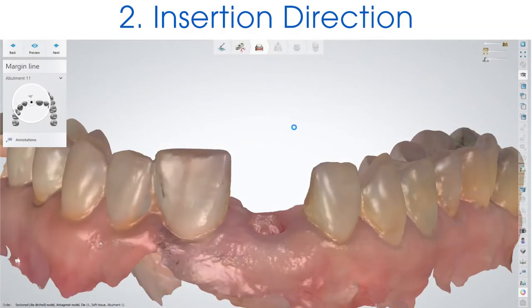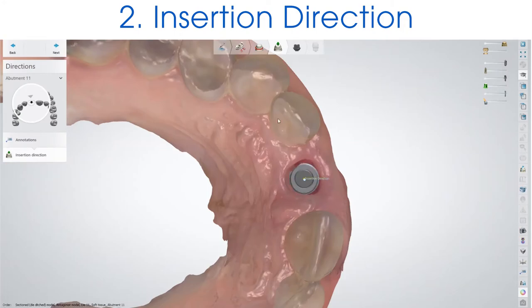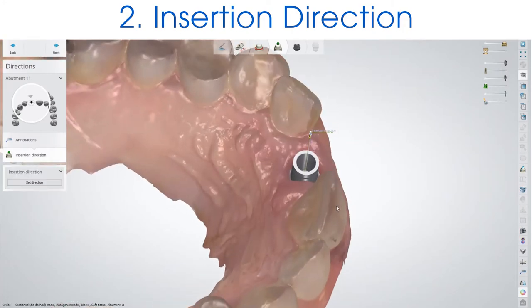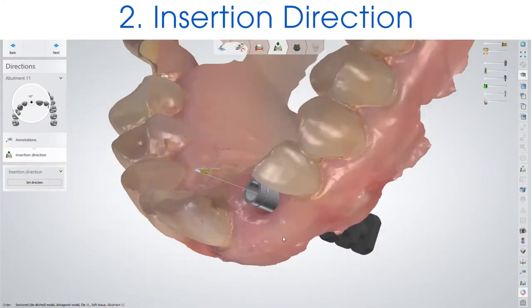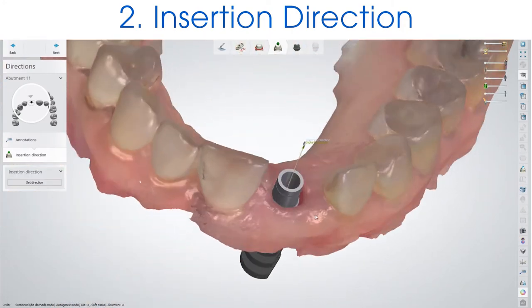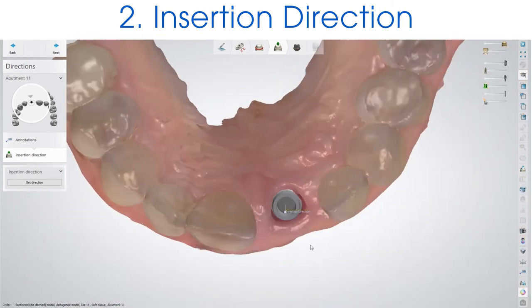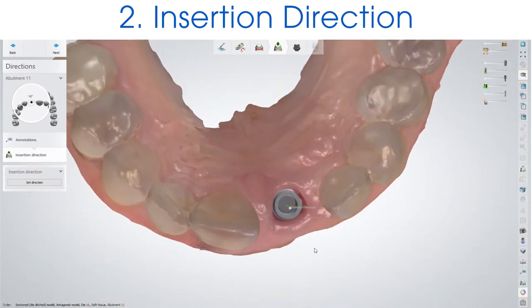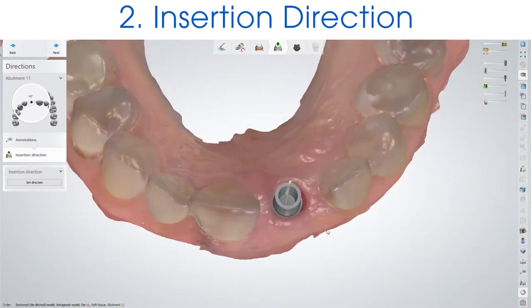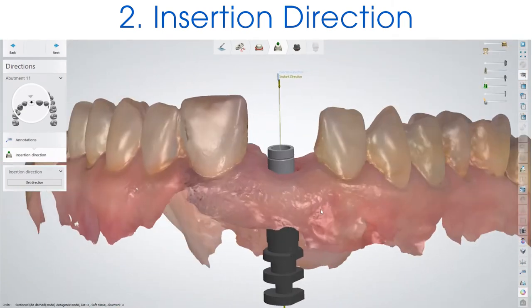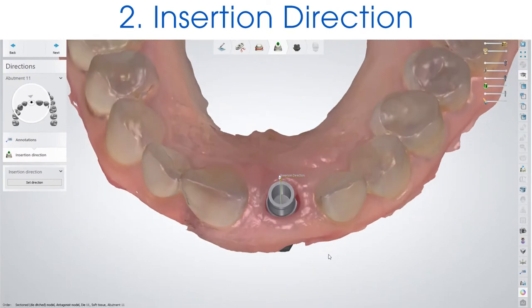The second step is the insertion direction. This is where you can set your insertion direction of your crown. This looks good, so I'll go to the next step. As you can see, the Open Implants titanium base is visible here.